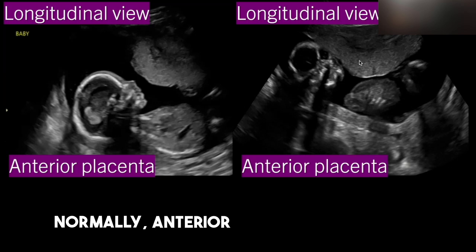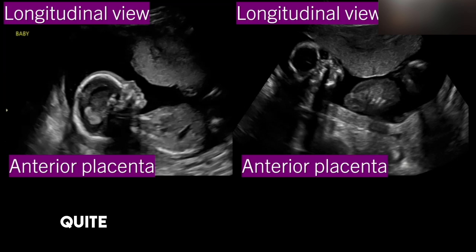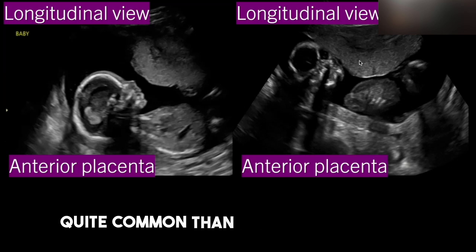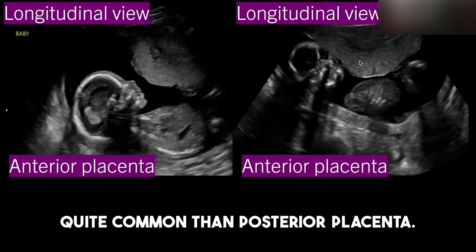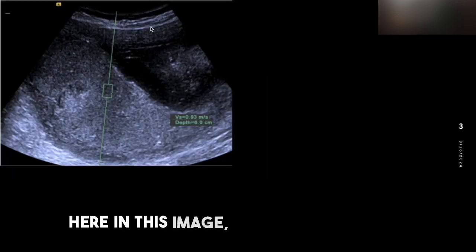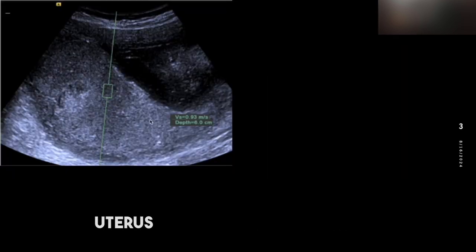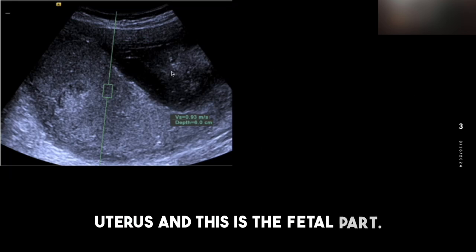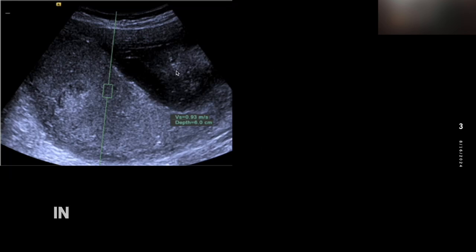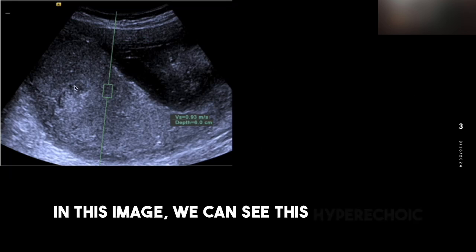Normally, anterior placenta position is quite common than posterior placenta. Here in this image, this is the maternal uterus and this is the fetal part. In this image, we can see this hyperechoic structure.